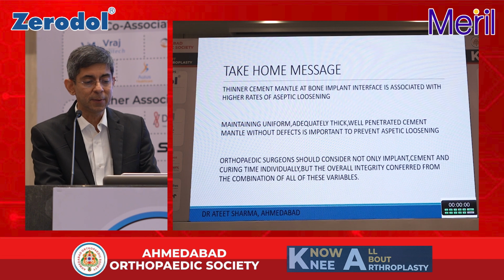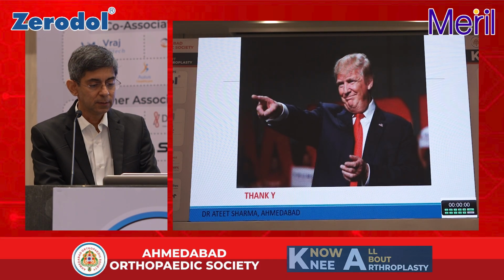Thinner cement mantle at the bone implant interface is associated with higher rates. Maintaining uniform, adequately thick, well penetrated cement without defect is important to prevent loosening. And orthopedic surgeons should consider not only the implant, cement, and curing time, but a combination of all these three variables.